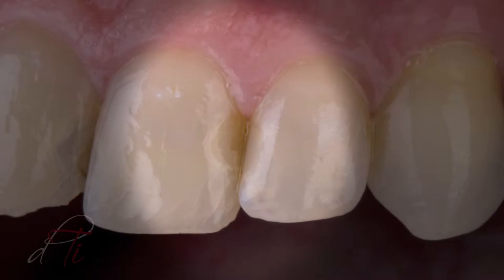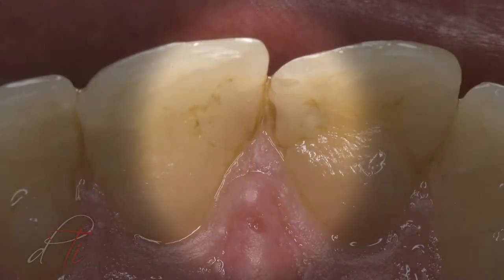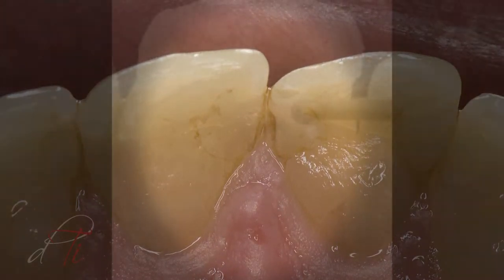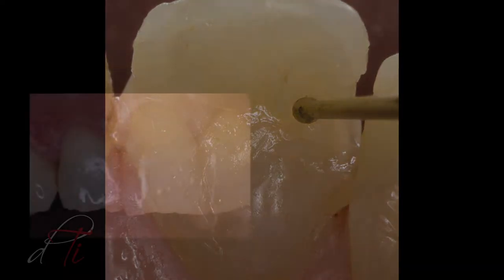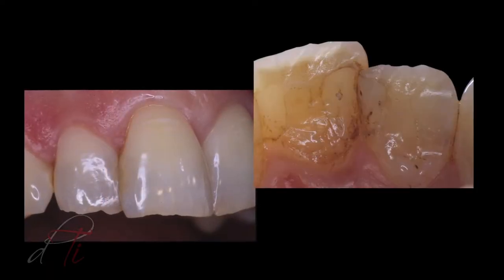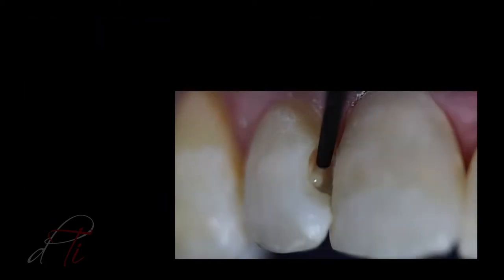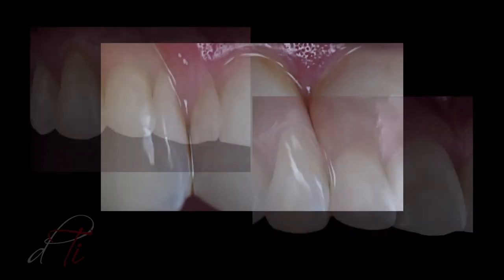Restoring the interproximal zone with composite resin restorations using conventional hybrid composites has always presented challenges. Improper placement of these viscous composite materials can result in gaps, voids, and inefficient marginal seal at the restorative interface. However, by utilizing a modified self-etch technique and a simplified placement of a next-generation flowable, an ideal tooth-restorative interface can be achieved.